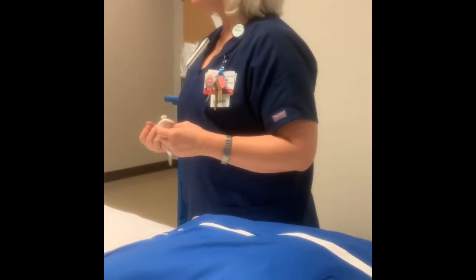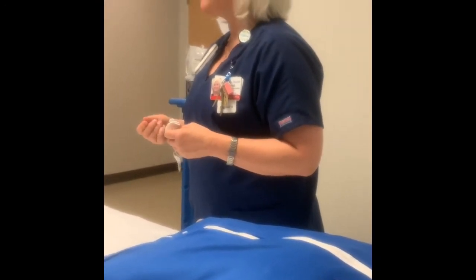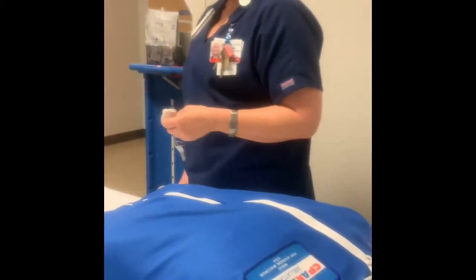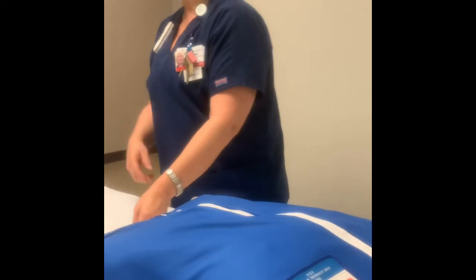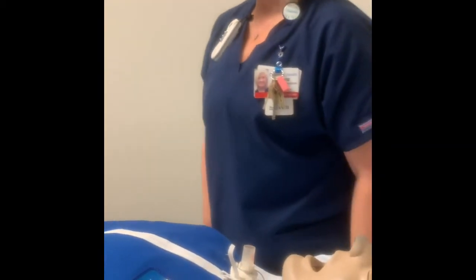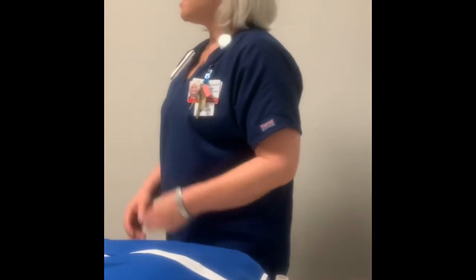In that event, first of all, if you call me, I would come over, and the first thing I'll say is, do they have an obturator? Well, we don't see one. I'm going to ask what size trach they have, and I'll grab one and pop over. Then I'll give it to the patient and tell them they have to keep it with them at all times, because you have to have an obturator to put that thing back in. So what sizes are there? You have 6, 7, 7.5, 8 trachs. So you have different sizes on trachs.